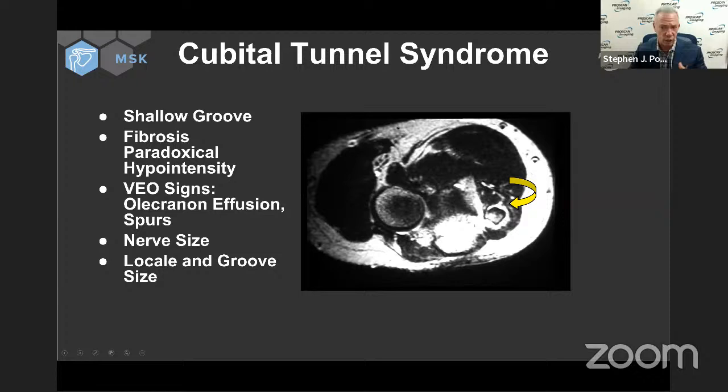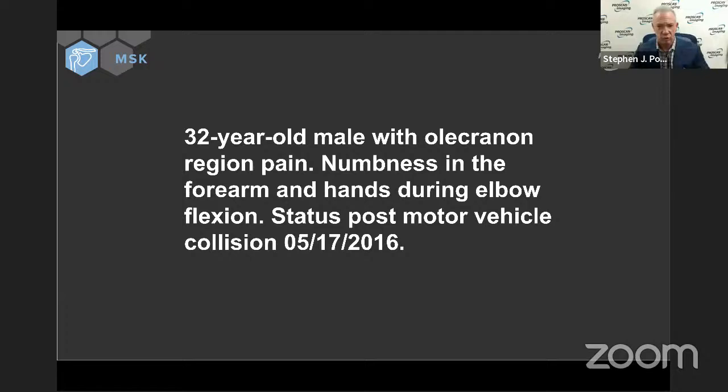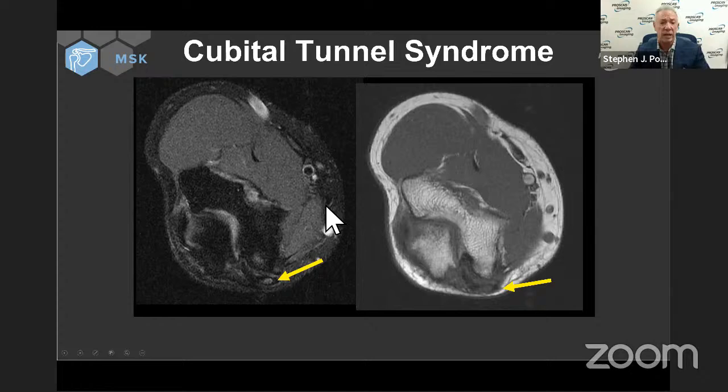This one was 1.2 centimeters. That's what cubital tunnel syndrome looks like. Here's a 32-year-old man with olecranon region pain and numbness in the forearm and hand. I believe this was an MVA case. Yes, it was. And here's your PD spur.